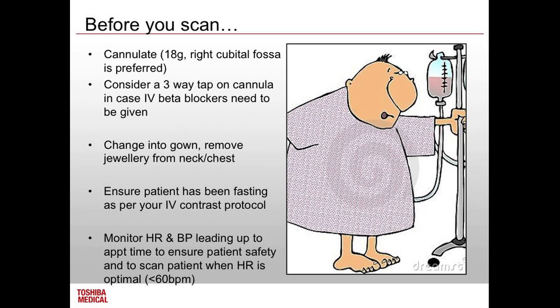The reason we put it in the right side is that, well, if it was dextrocardia, you'd turn them around, it's a faster route to the heart. That's all. But the only other time you wouldn't put it in the right is if they had a coronary artery bypass graft, and if they used the RIMA rather than the LIMA, which is weird. The RIMA is the right internal mammary artery, which they take off the chest wall and attach to one of the blood vessels. So we put the cannula in the left.